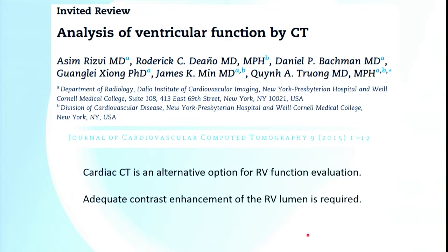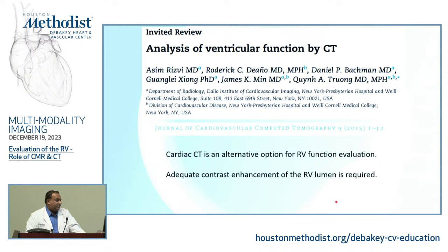This is a very nice review from JCCT, from one of my prior colleagues, Quynh Truong, talking about the analysis of both right and left ventricular function by cardiac CT. Of course, most of the review is taken up by the LV, but again, they mentioned that cardiac CT is an alternative option for RV function evaluation. However, adequate contrast enhancement of the RV lumen is required.